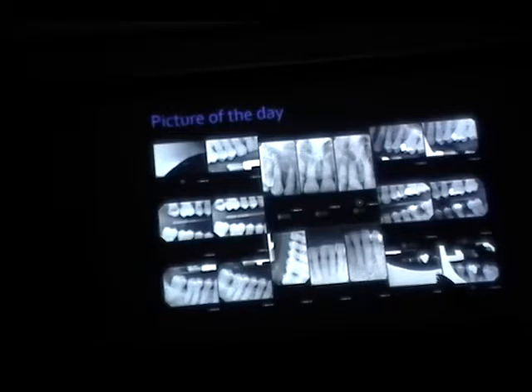what is the problem with this particular thing? Put the sensor the wrong way, right? Because you can even see part of the little fingers attached. When you compare this and this, I'm only talking about the contrast or density. What is the difference between this and this? It's darker. Which one do you think is better? The one on the right.